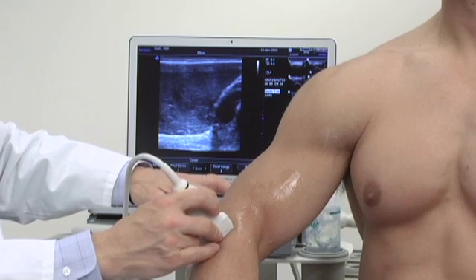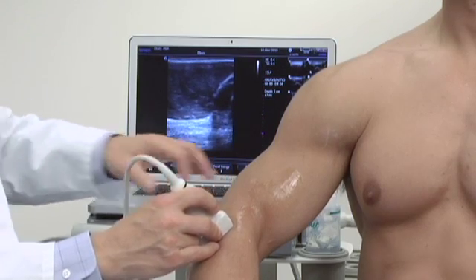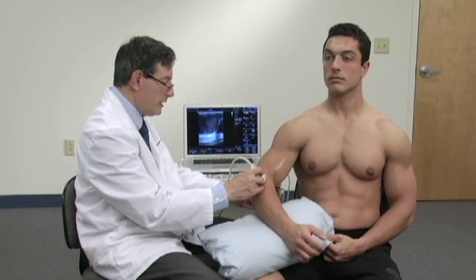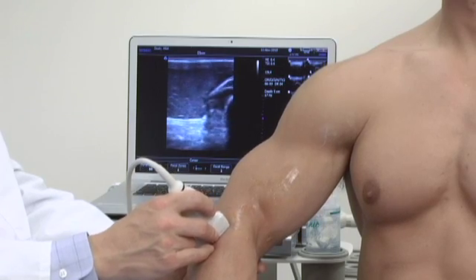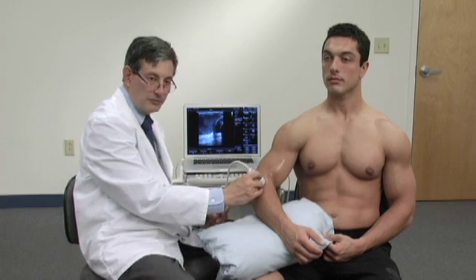I'm going to give us another step of depth to make it a little easier to see. Bring the focal zone right down over that area. And I'm going to ask him to internally and externally rotate his hand — pronate and supinate. You'll be able to see dynamically that tendon moving. This is a good way of being able to see the distal aspect of the biceps tendon.